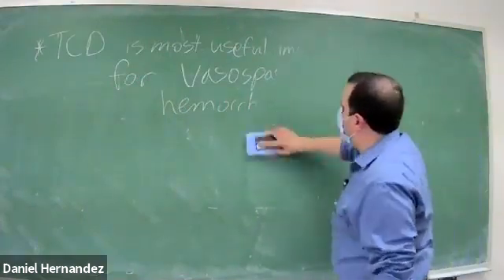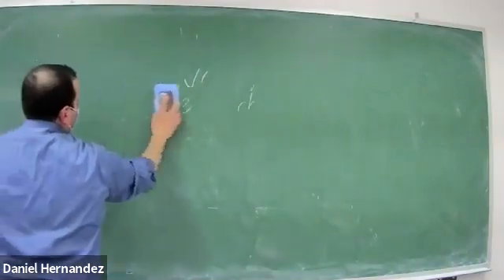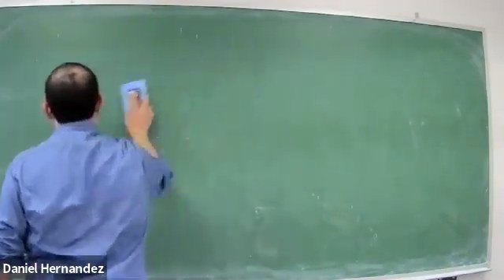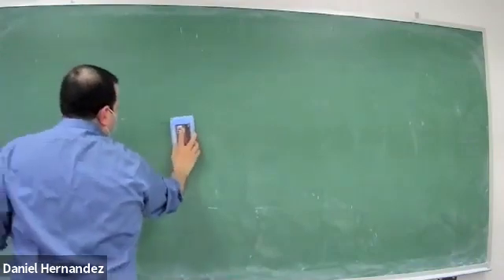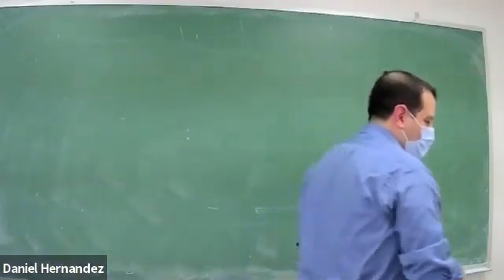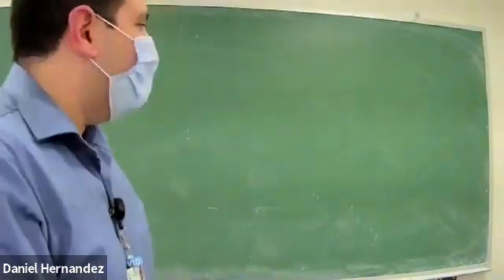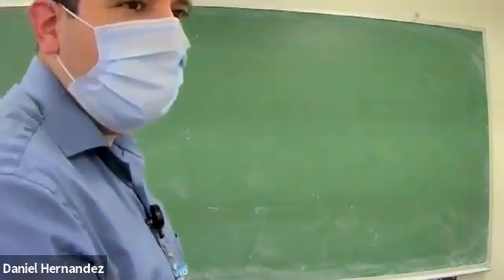Can anyone tell me what patient position is best for doing a reflux study or assessing for insufficiency? Standing. Standing, yes. That's why we even have the test called the standing reflux test, which is terrible and horrible on your back. But yes, we like to have the patient standing for doing reflux studies.